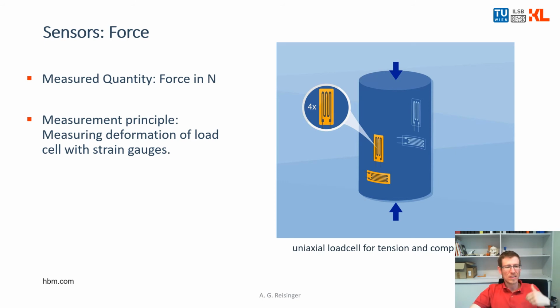You know, for example, okay, this is steel. You also know the cross-section area of that. So by knowing the strain measured by the strain gauges, knowing the stiffness or the material properties of this rod and the cross-section area, you can calculate the force that must have been applied on this rod. So after some calculation out of the strain measurement, you get a force reading. So force in our experiments is measured by strain.